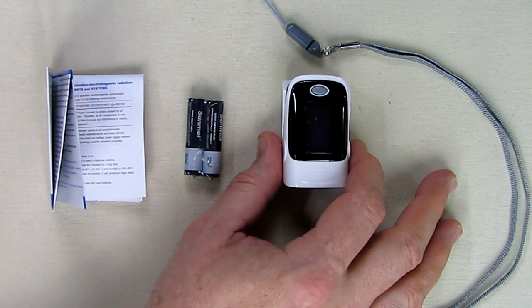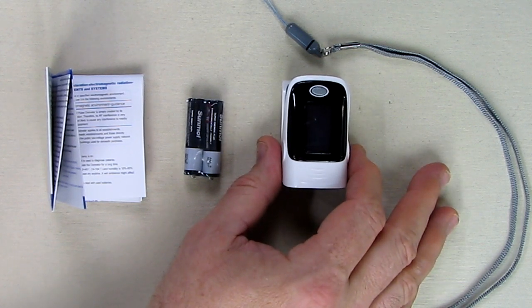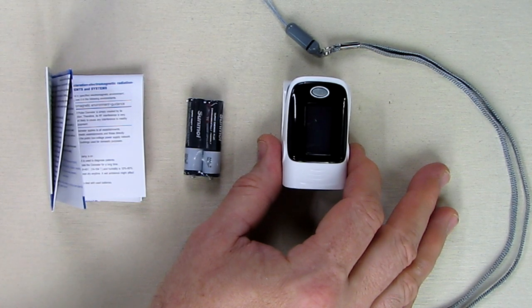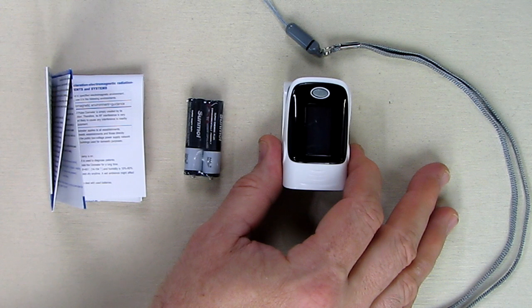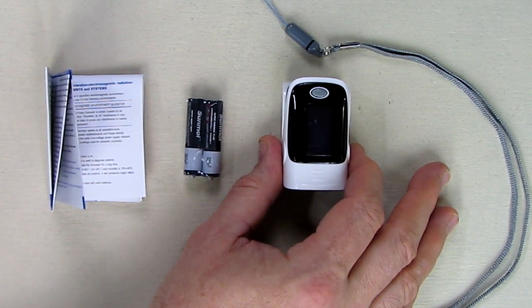The seller provides a 30-day money-back guarantee and a one-year warranty on the product. The accuracy of the SPO2 is plus or minus two percent and the range is 35 to 100 percent. This will work with children four years and older all the way through adults. There's a little LED inside that you line your finger with, and the measurement takes eight to ten seconds to complete.